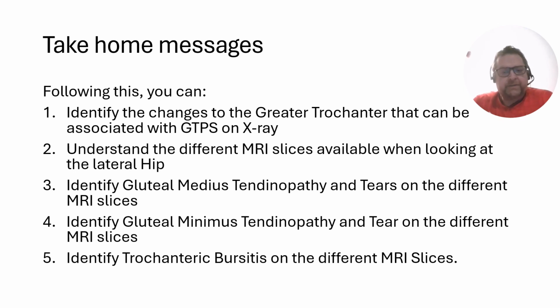So, following this brief video, the take-home messages: you should be able to identify the changes to the greater trochanter that can be associated with GTPS on X-ray.